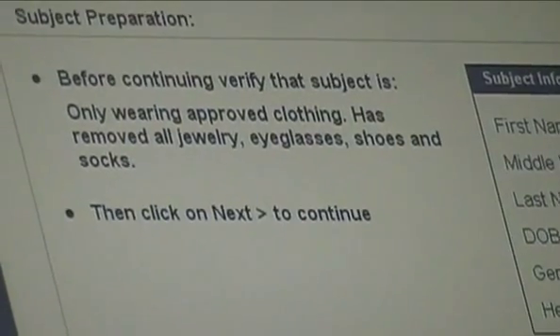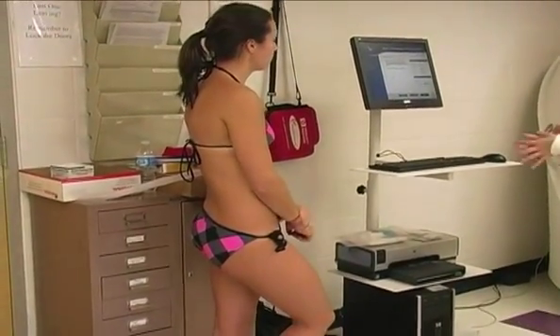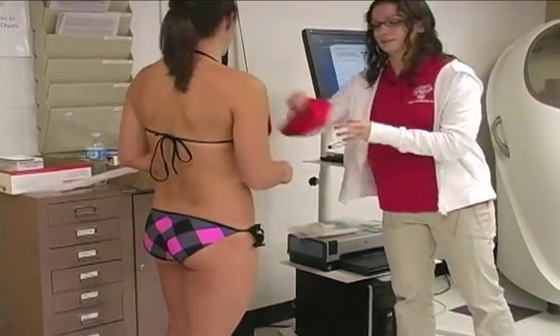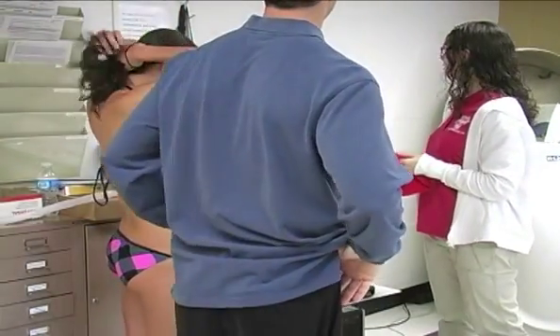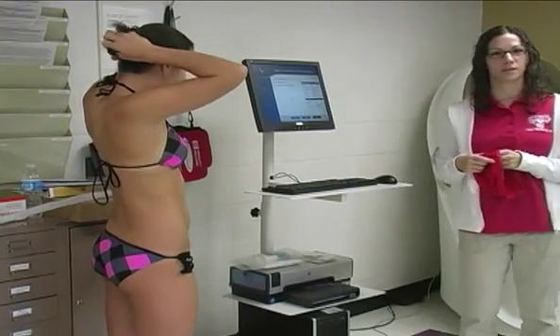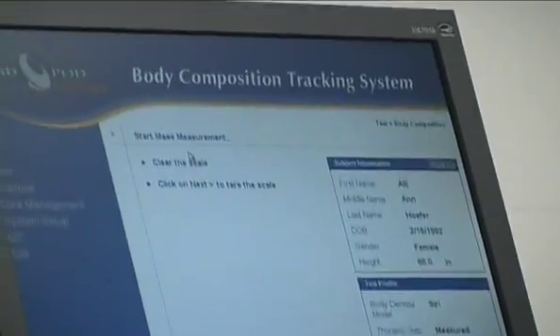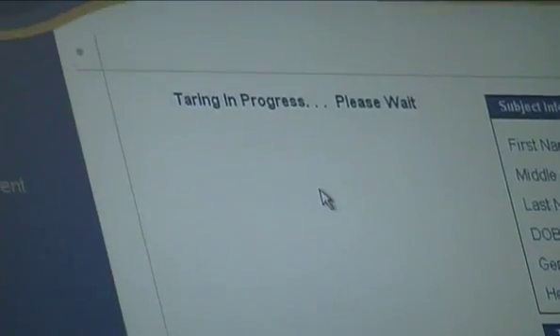Okay, so now we're gonna make sure that she's wearing only approved clothing, no jewelry, eyeglasses, shoes or socks. She's in a two-piece bathing suit, and we'll need to put the cap on over her hair. Put that on later. Okay. So do the scale first. Tare the scale. So we're making sure that there's nothing on the scale, and there isn't. So we're gonna tare it. So we're zeroing it out.